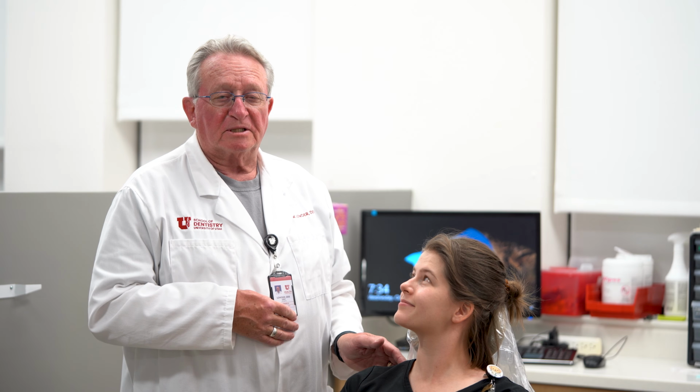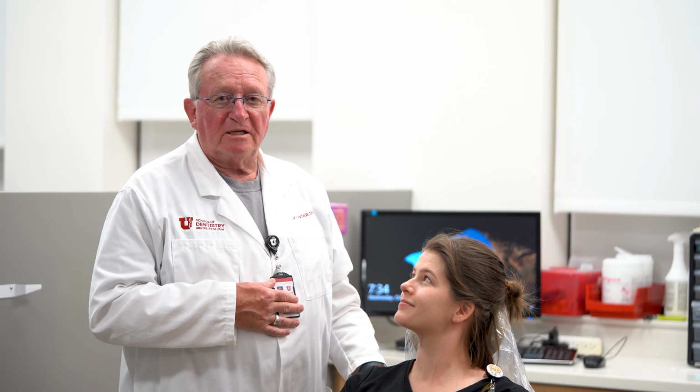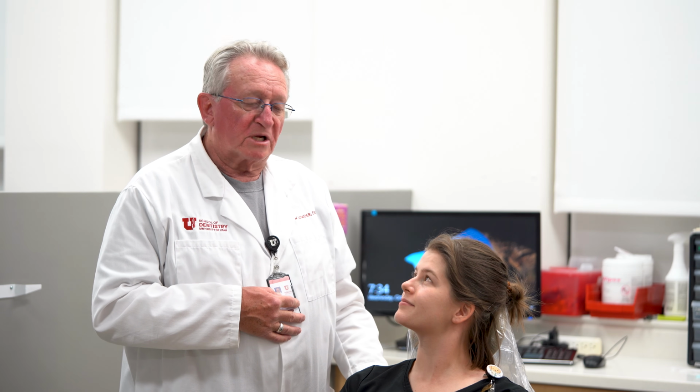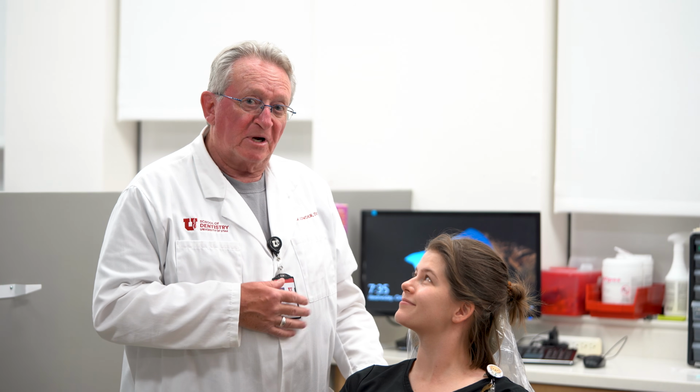It doesn't always happen, but it's really pleasant when it does, because it tells me that the pain she was experiencing is most likely local muscle soreness or muscle strain from perhaps being a dental student and treating patients all day. So I hope that helps to better understand the use of this product and how it can be used for diagnosis for the patient, especially detecting muscle involvement in tension type headaches and jaw and neck pain.